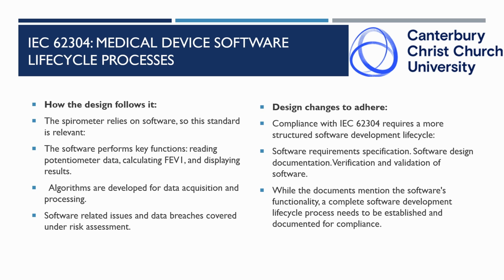Design changes that we wish to implement to further comply with IEC 62304 are software requirement specifications, software design documentation, and verification and validation of software. While the documents mention software's functionality, a complete software development lifecycle process needs to be established and documented for compliance.